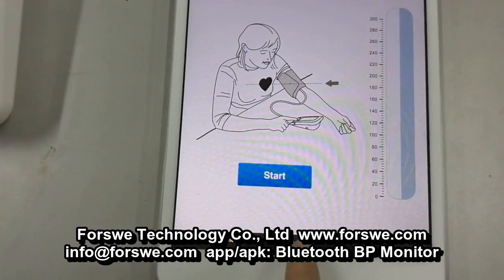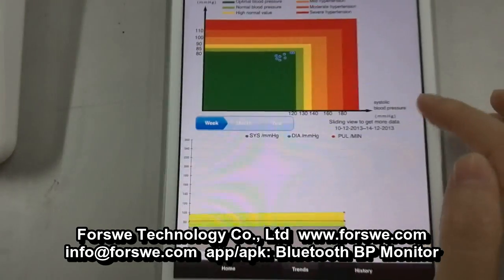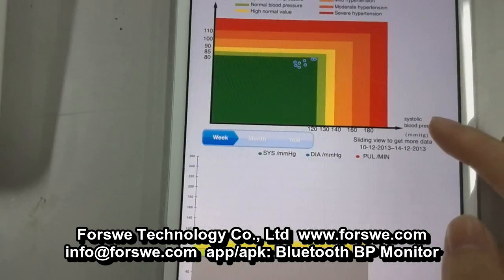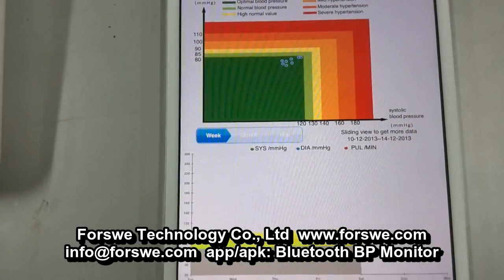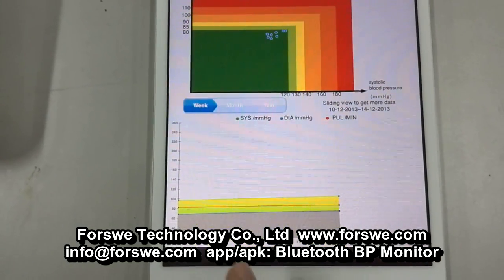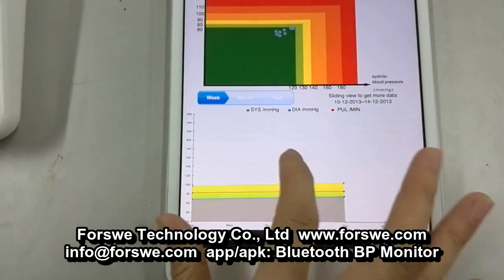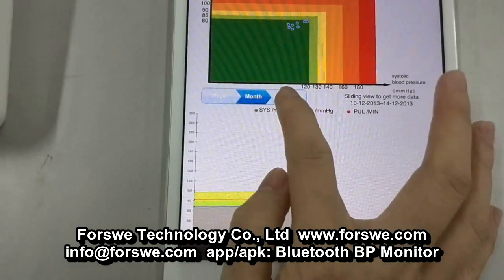Now turn to the Trends page. In this page, you will see the general blood pressure trends. You can also slide to see the general data weekly, monthly, or yearly.